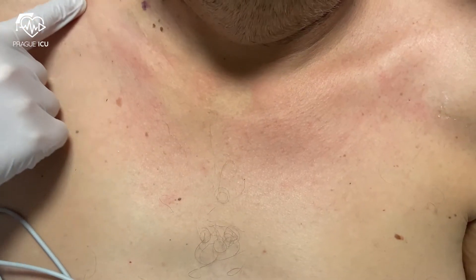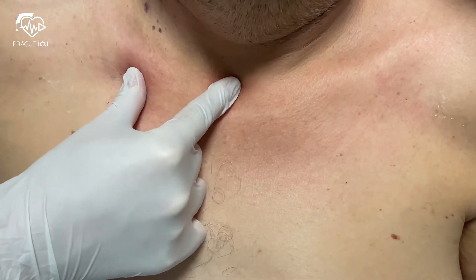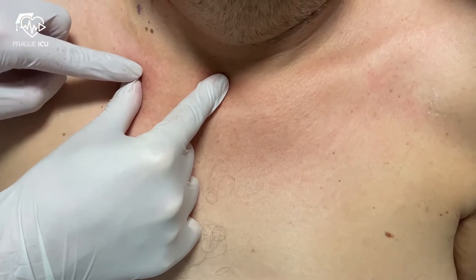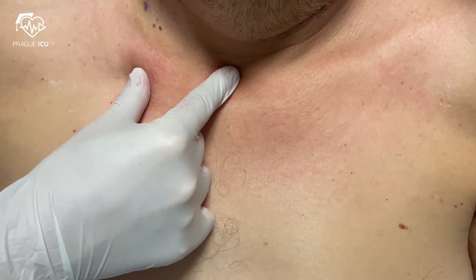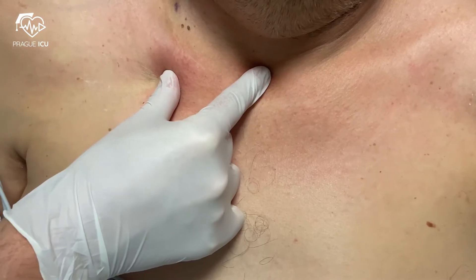The infraclavicular approach is most commonly used. The insertion site is inferior to the clavicle at the junction of its medial and middle thirds, or just inferior to the clavicle at its midpoint. The middle third begins at the point where the clavicle angles posteriorly.